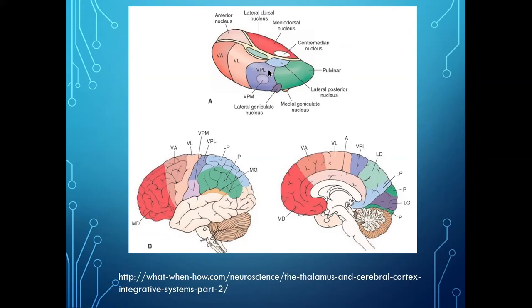The sensory input, the motor regulation, the premotor, the cingulate, and the frontal and anterior cingulate. And then central median ends up having the temporal lobe limbic structures hooked to it. It's very, very tightly connected. So when we see something in the front here, it's not exactly a posterior sensory relay. If you see alpha up in the front somewhere, it's not a sensory related feature. It's projected from other nuclear bodies up to the front.